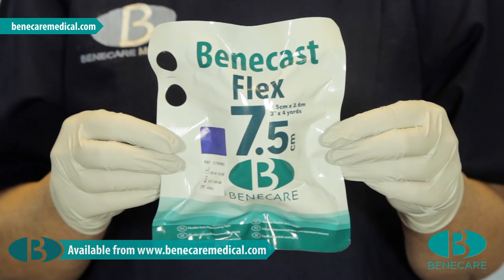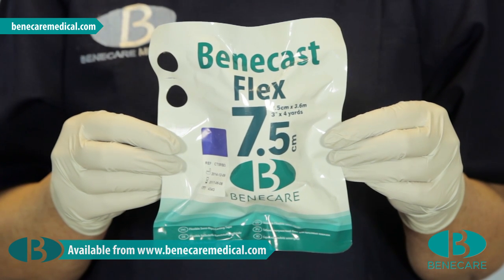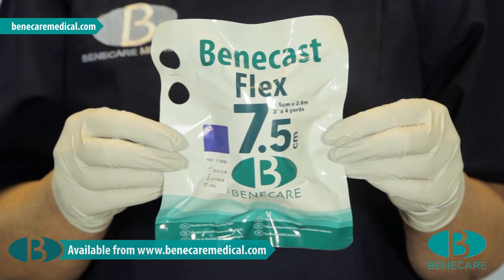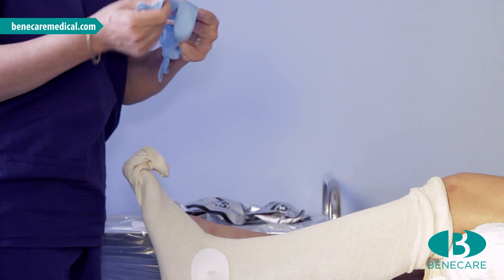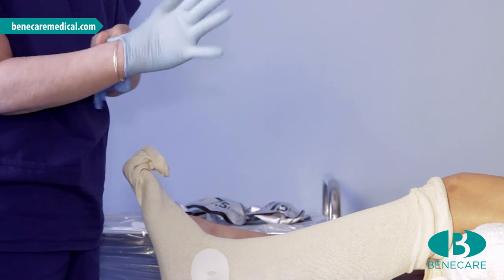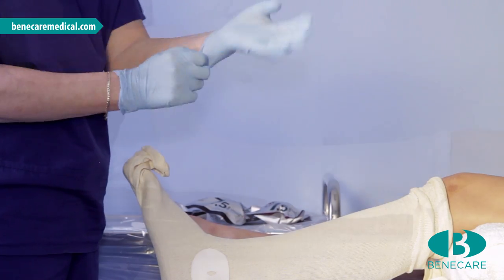Using the Benecast Flex, which is a semi-rigid casting material, use it dry as it laminates to the stockinette better and allows more working time for the clinician with less experience or for the difficult patient. Apply examination gloves — it is important that gloves are always worn when applying synthetic casting materials of any kind to protect the skin.